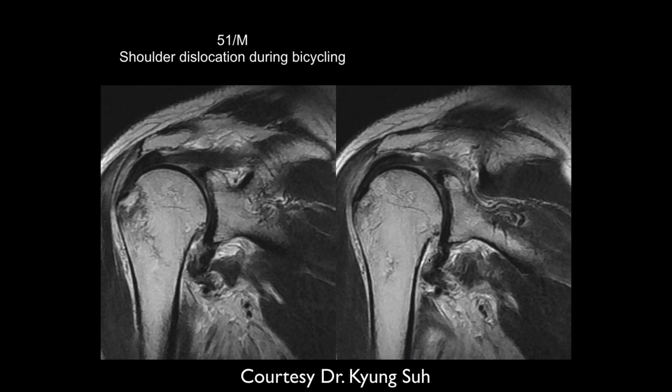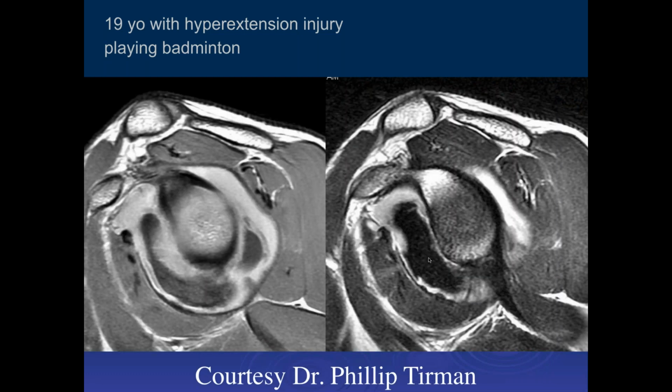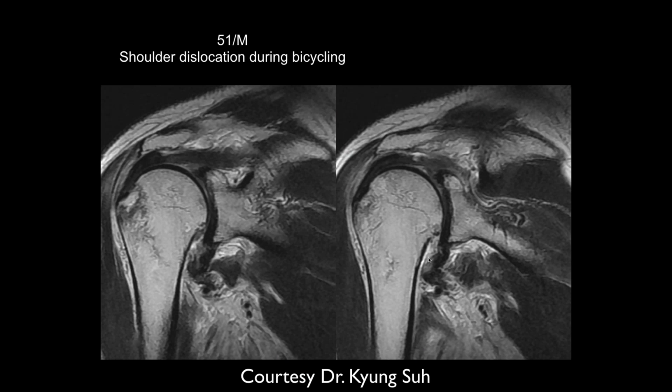That's because it's a humeral avulsion, right? Yeah, I think so. And there was a lot of hemorrhage there, right? Because the labral tears don't bleed. Right. Okay, Sam.